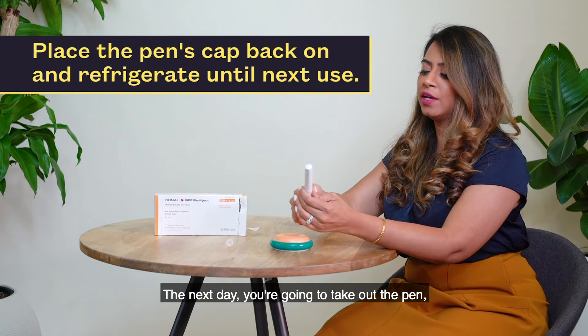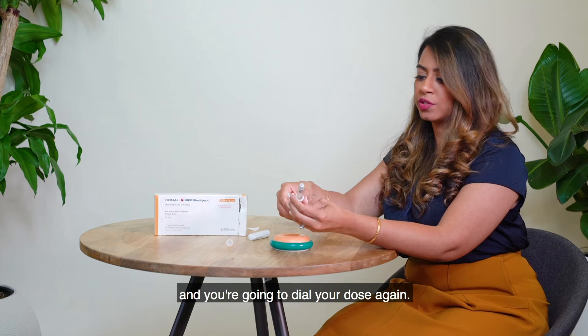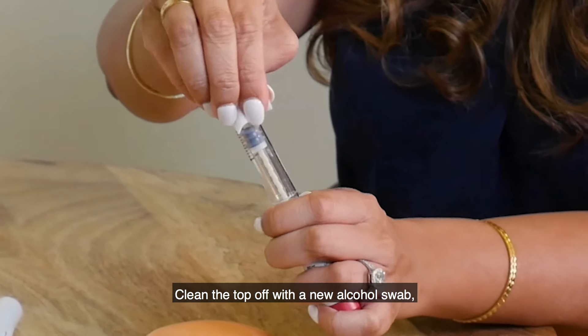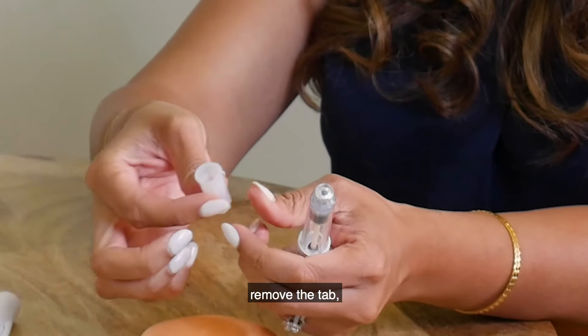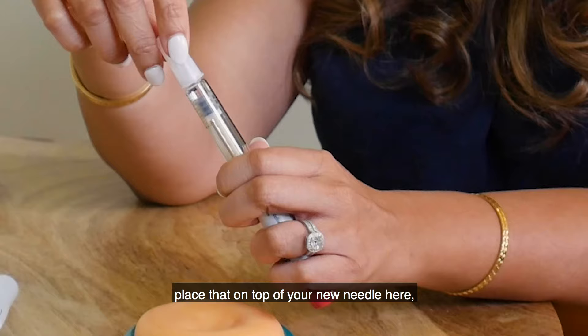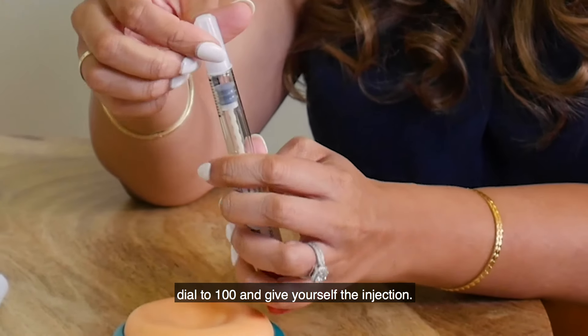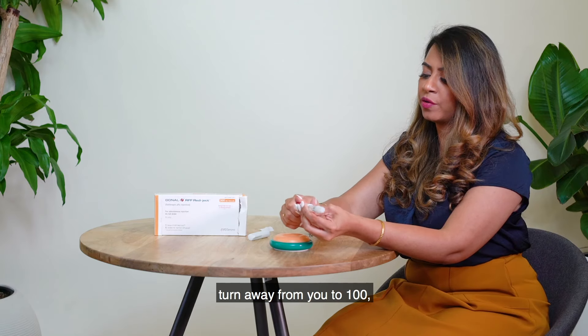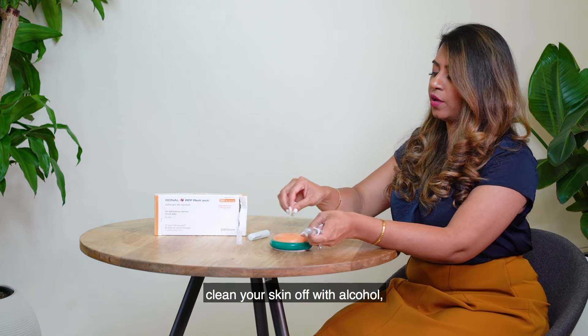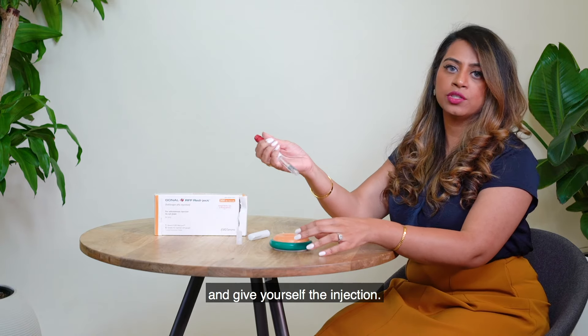The next day you're going to take out the pen and dial your dose again. Clean the top off with a new alcohol swab. Take out a new needle, remove the tab, place that on top of your pen, and dial to 100 and give yourself the injection. Remember — turn away from you to 100, take off the cap, clean your skin off with alcohol, and give yourself the injection.